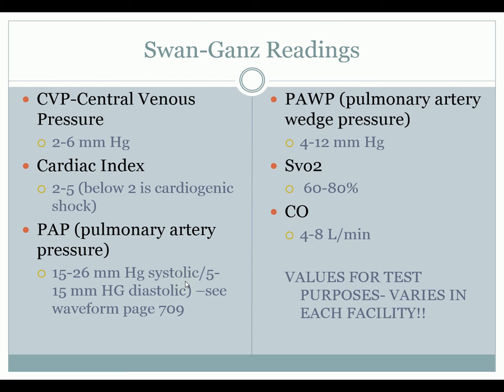Once you record the reading of the pulmonary arterial wedge pressure, for example, if you look on page 771 in your book again, on the left-hand side of the page, you will see the typical waveform that you'll always see. Then when you get the typical pulmonary arterial wedge pressure tracing, you can see that reading goes way down and almost flip-flops. That's when you know you've got the pulmonary arterial wedge pressure reading.